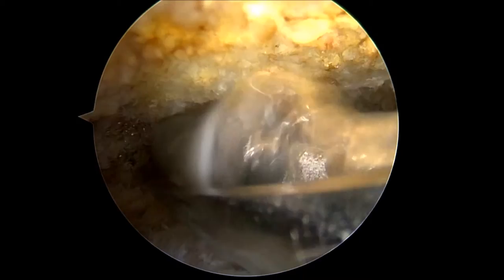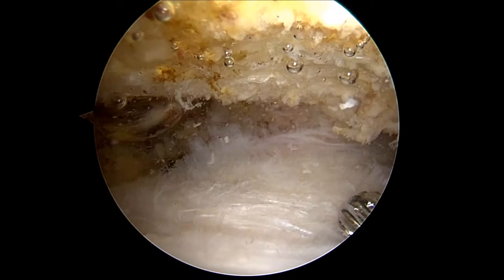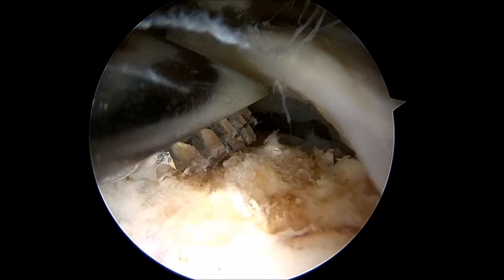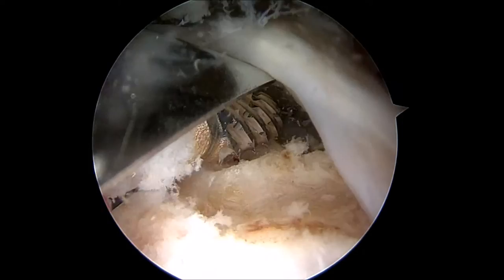This portion of the procedure is known as an acromioplasty. After the acromioplasty is complete, you can see there is a flat, bony acromial surface. Next, the rotator cuff is viewed from another angle to get a better perspective on the tear. Then the arthroscopic burr will be reinserted to freshen up the bony surface of the humeral head and to remove all soft tissue debris in this area. The goal is to create a bleeding bone surface which will maximize the ability of the tendon to heal down to the bone once the repair is completed.